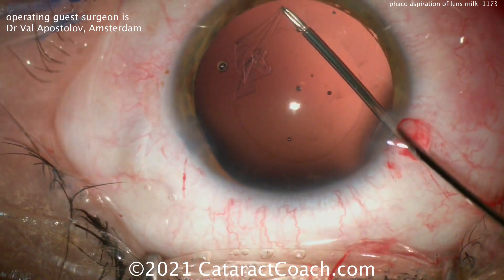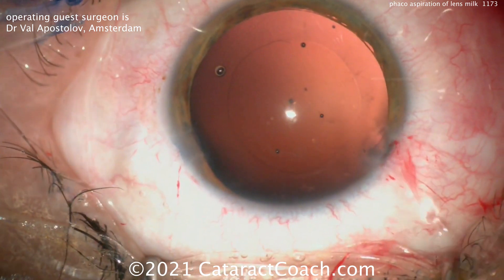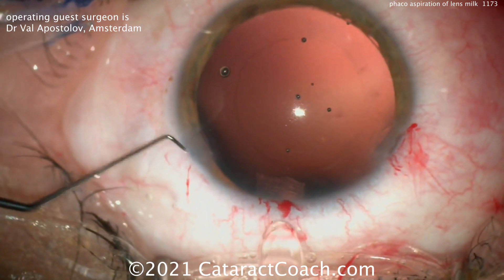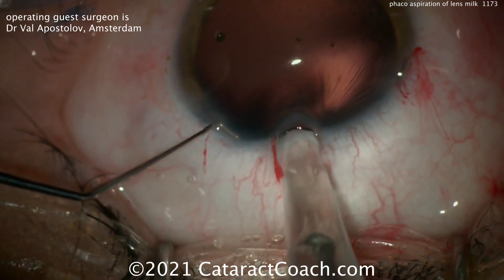The rexis looks beautiful — that's fantastic. Now let's see what happens with the lens insertion. We're likely going to need a new incision for that, and there it is — a new incision at the patient's 12 o'clock.